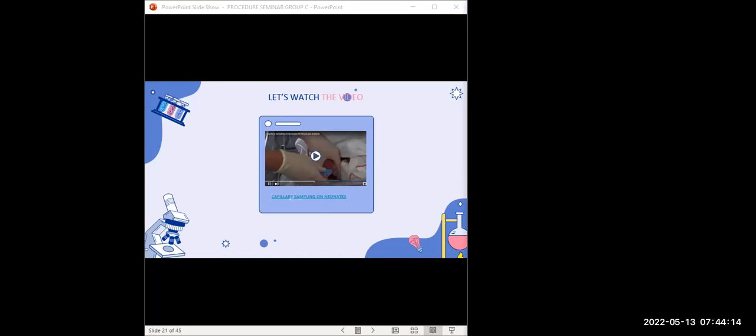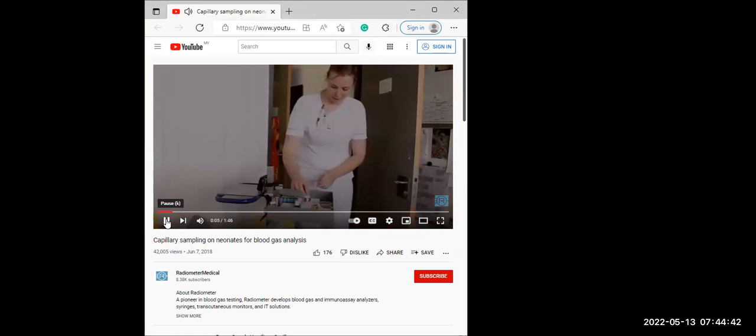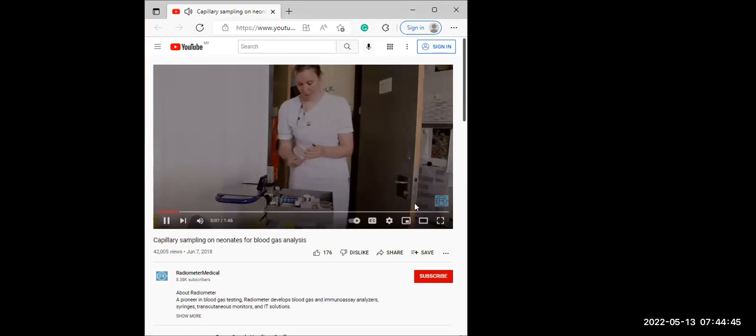This is an instructional video. This is an instructional video about how to collect a capillary sample from a neonate. When sampling, be sure to always follow your hospital's procedures.